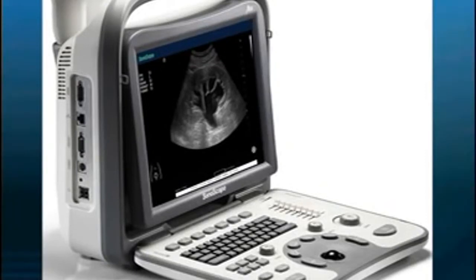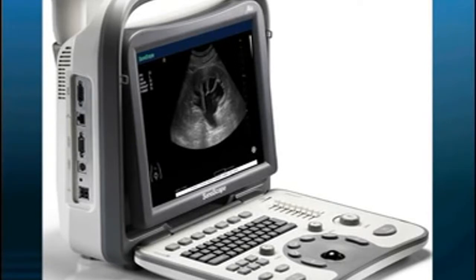Being able to understand a few basic physical principles about how ultrasound interacts with various human tissue, as well as having a working knowledge about the key buttons used to control the ultrasound machine, will maximize your ability to acquire quality images in a timely fashion.